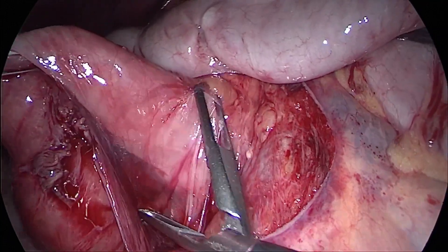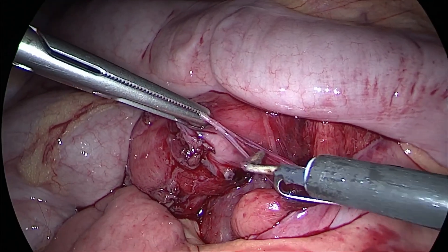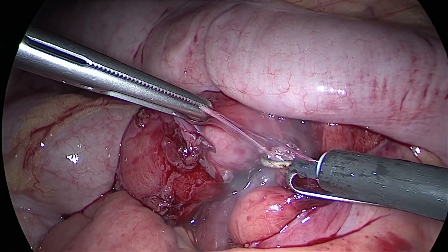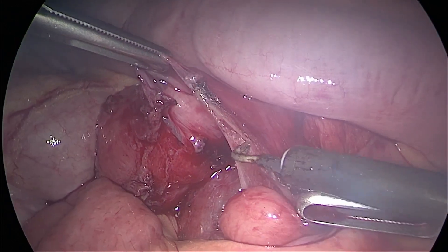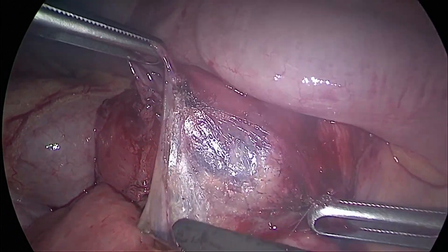The duodenum is further mobilized towards the midline to achieve maximum length for side-to-side duodenojejunostomy.